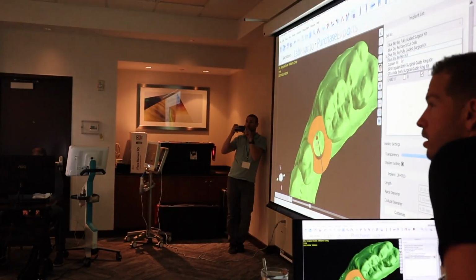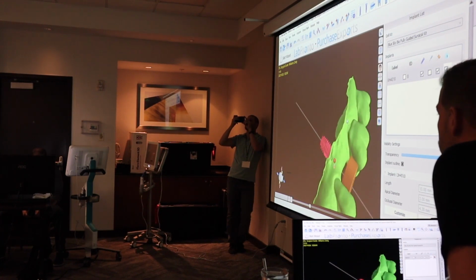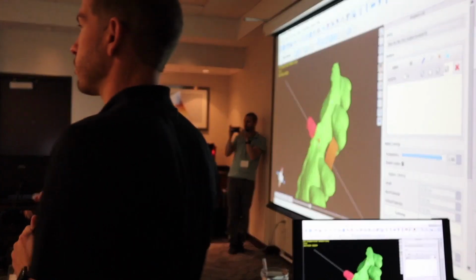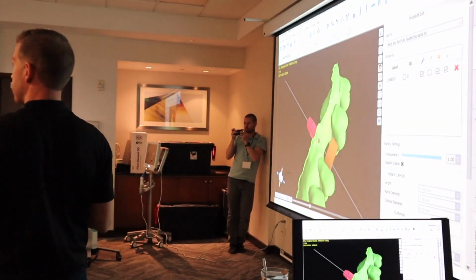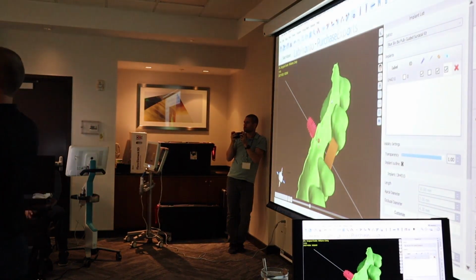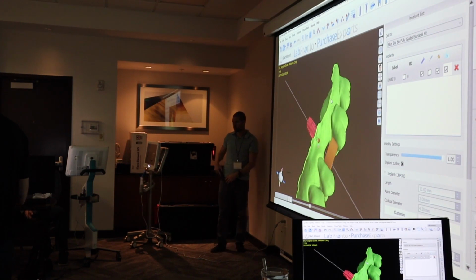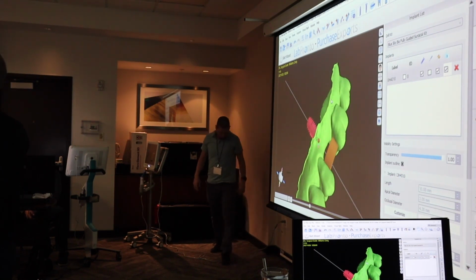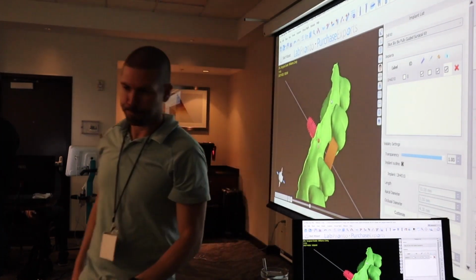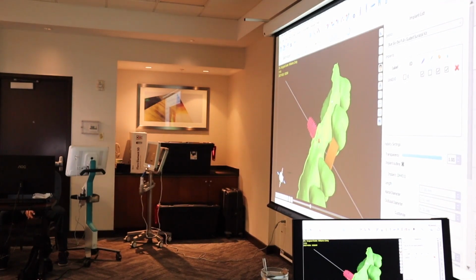Once you've learned all this, Matt, have you seen any need for a pilot guide? No. Personally? No. It's just, if it was just like an upper lateral or something, and there wasn't enough space for the guide tube, then you might have to. Yes, actually, that makes sense. Yeah, totally. Because sometimes, lower incisor, right? Lower incisor, sometimes you don't have 5 millimeters to fit all that. So yes, sometimes you have to go pilot, and you're putting in like a 3.0 implant.